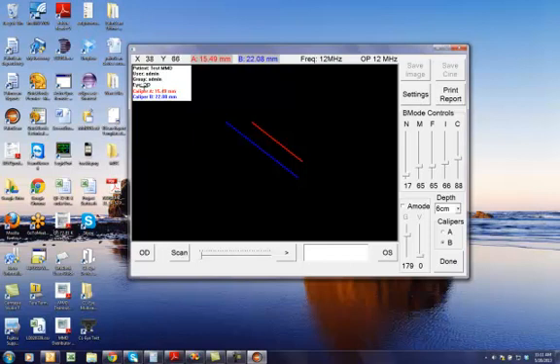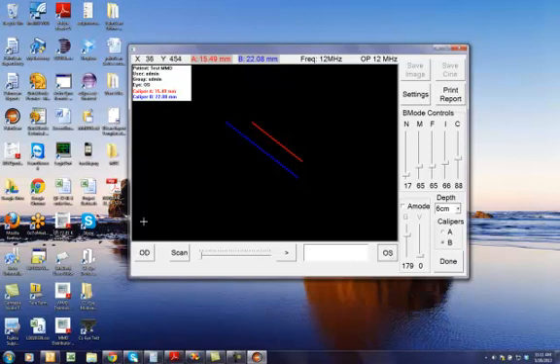as well as the eye that has been selected. So, if I switch on the OS, you will see that the eye type changes. Also, the caliper values are also displayed here in that corner, as well.